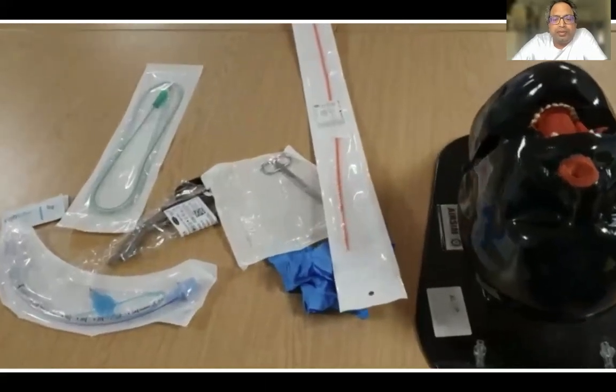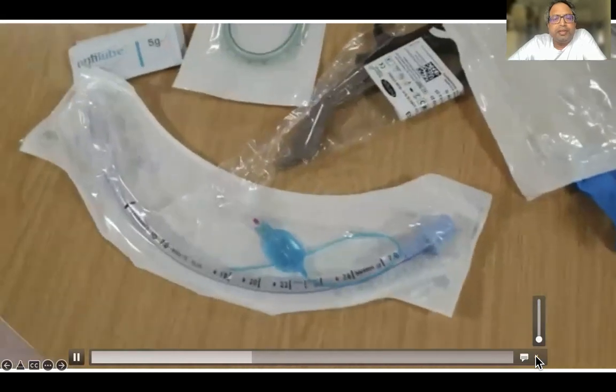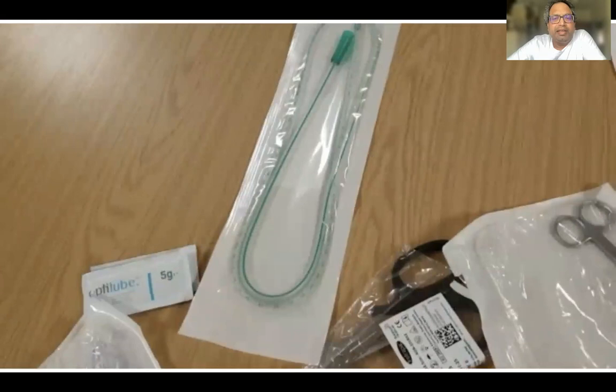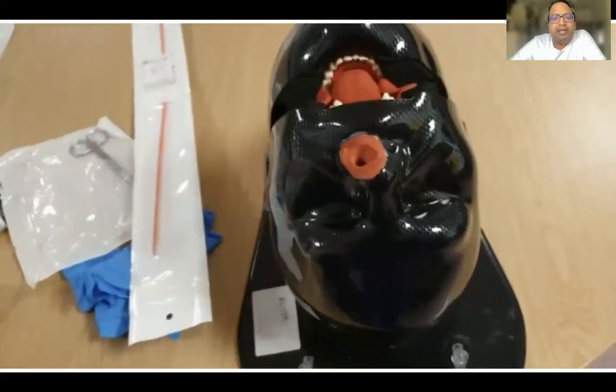These are the things we require today for this project. So here we see the various things we need: NG tube, of course, and the endotracheal tube, a scissors, and we got the mannequin.